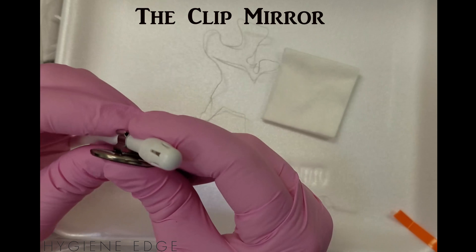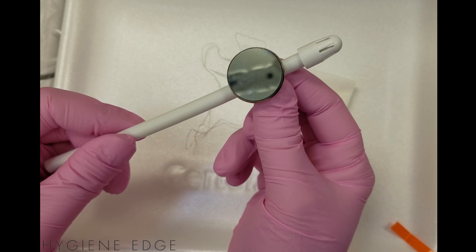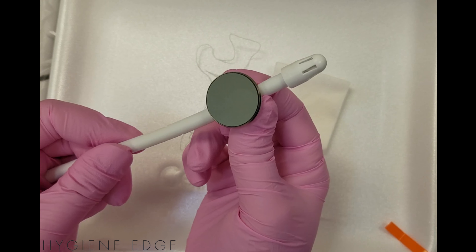This is the Clip Mirror, created by a fellow hygienist. It attaches to a standard saliva ejector to create a suctioning mirror.